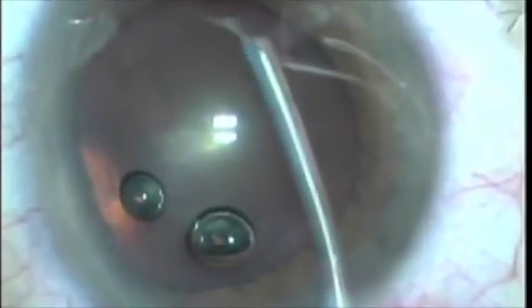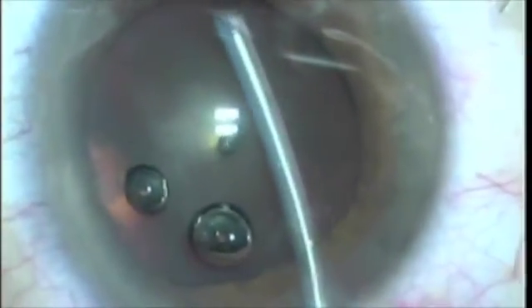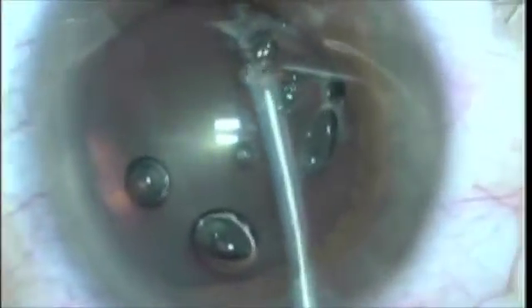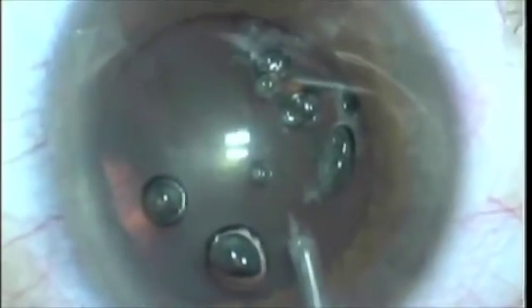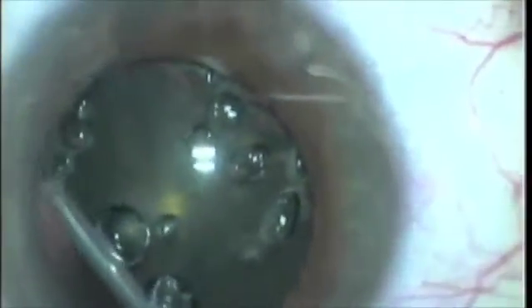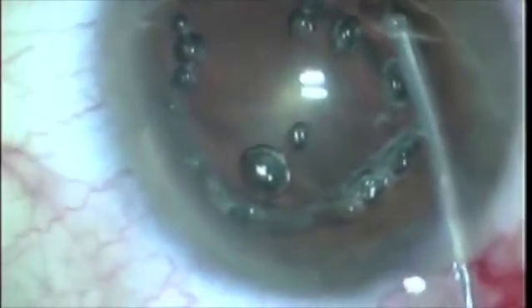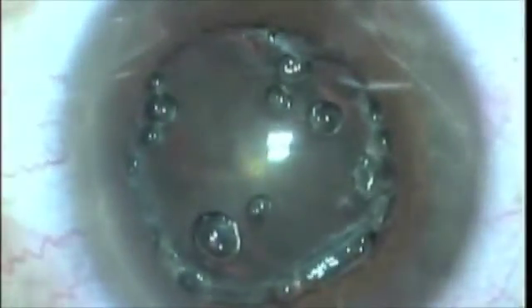Here, my cannula accidentally put a perforation through that anterior capsule. So I have a tear. I'm going to go up under the iris as far out as I can and get an ablation path in front of the tear in the capsule. If you get an ablation in front of the capsule, you will stop a tear in the capsule. That's what I just did — I put an ablation path out and went a little further, so now I have an ablation path sitting in front of the tearing head.